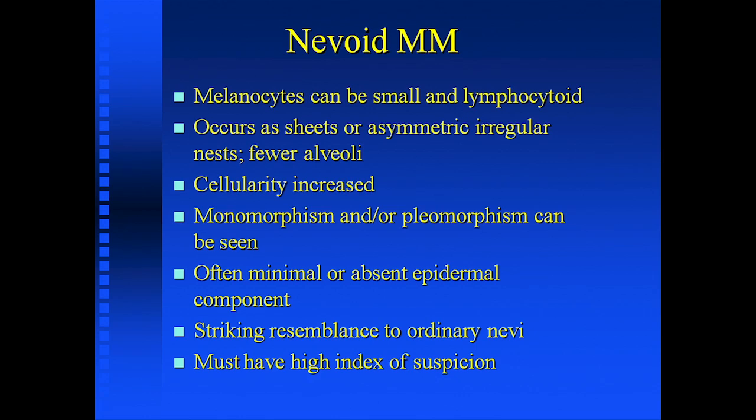Here is my advice. If you see a nevus and it doesn't show theques, and it just shows sheets of melanocytes, and the cells all look the same, give it that second look. Don't do that one second, next slide type of thing. Look for those mitotic figures.